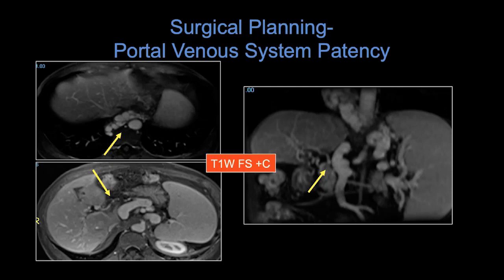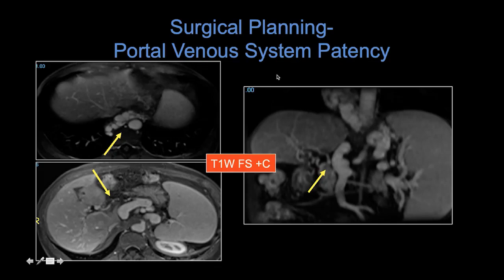Portal vein patency is really important. Here you can see the main portal vein is thrombosed with numerous varices. It's very important to tell them the degree of thrombosis, how long it is, where it extends, so that they can think about doing a graft that bypasses the thrombosed vessel. It's also really important to look at the hepatic veins and the IVC and make sure those are open. All of those are really important for surgical planning.